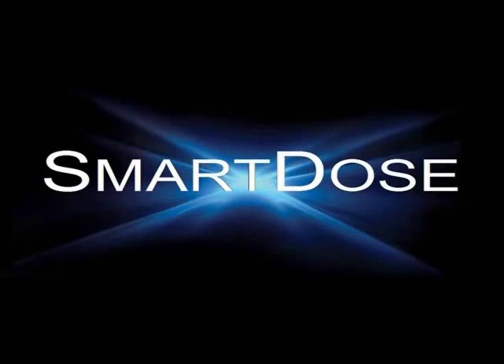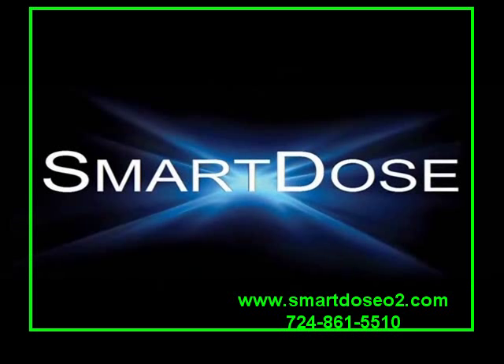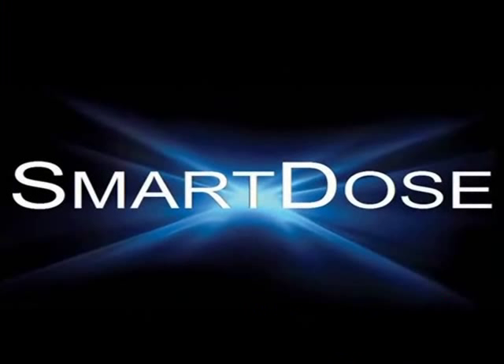Well, that's it for the quick overview. As you can see, the SmartDose Mini is very easy to use. In general, place it on a cylinder and turn on the gas supply, attach a cannula, turn it on, and start breathing. For more information, check out our website at www.smartdose02.com or simply call us at 724-861-5510. If you'd like to see how the unit automatically adjusts to activity levels, go to the SmartDose demo video on our website. Make SmartDose your standard and remember, ask for it by name — SmartDose.